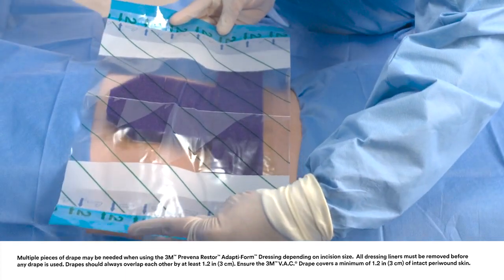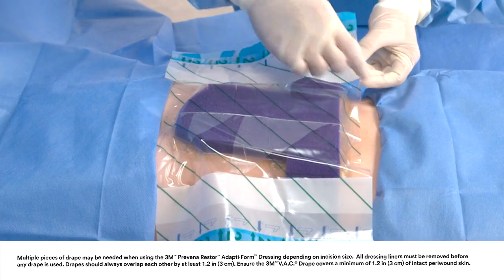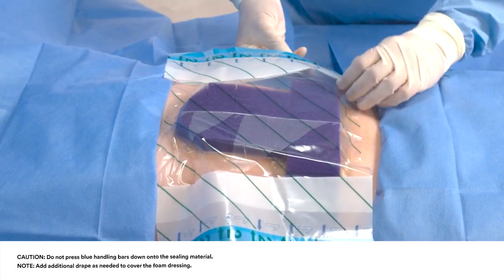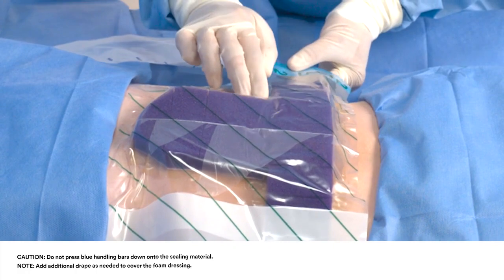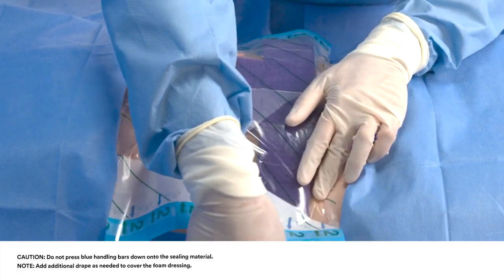With the adhesive side down, apply the drape over the foam and onto intact skin. Lift the drape at both ends and remove the two remaining end sections of layer 1. Smooth out any wrinkles in the drape to remove creases and seal joints, ensuring an occlusive seal. Carefully remove striped layer 2 from the drape.